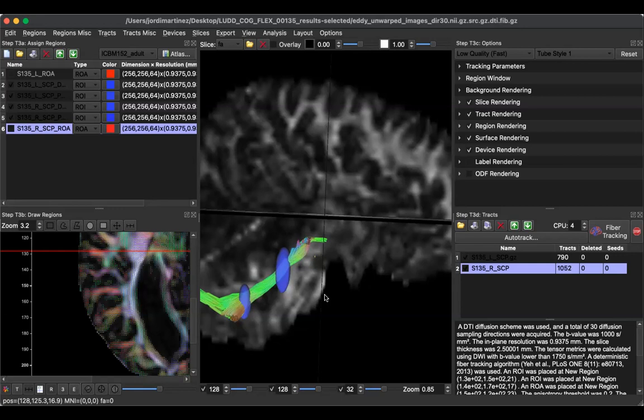Well, they probably have one. It's just offset from where you would see it in a normal kid, right? Because in a normal kid, you've got hemispheres and you've got the tracts between them. In agenesis, they're pushed together like this, right? So the cingulum will be really close to the midline. Well, let's look at a normal kid's cingulum. I guess you could see they're usually offset from the midline, right?